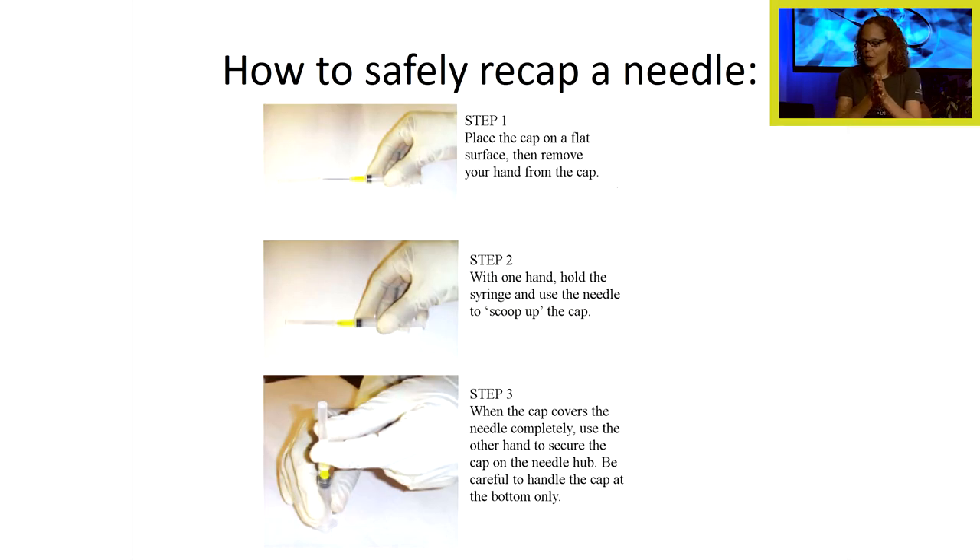To safely recap a needle for transport to the patient's room, place the cap on a flat surface, take your hand away from the cap so you don't stick yourself, then take your hand with the syringe and use a scooping motion to scoop up the cap. When the cap covers the needle completely, use the other hand to secure the cap onto the needle. This will prevent sticking yourself. There are other ways to safely recap a needle which you'll learn in lab.